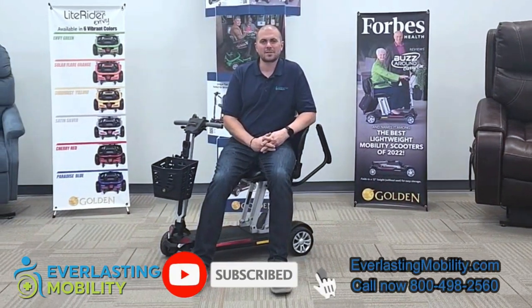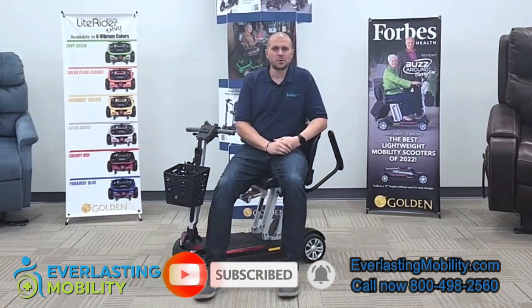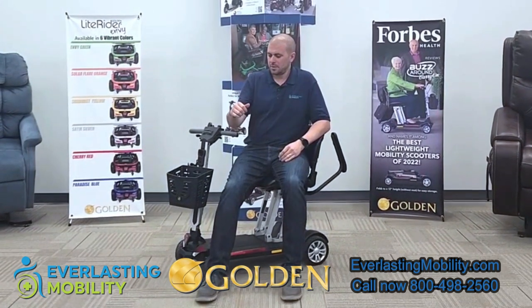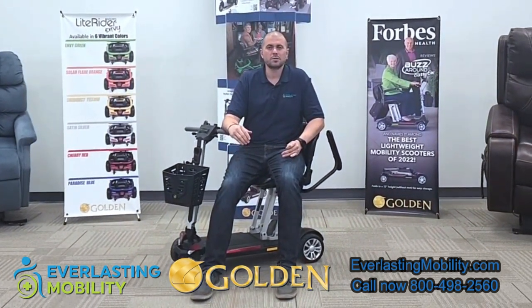Hi, this is Kel from EverlastingMobility.com. Today we're visiting Golden Technologies Corporate Headquarters and in this video we're going to go over the Buzzaround Carry On. It's model number GB120.